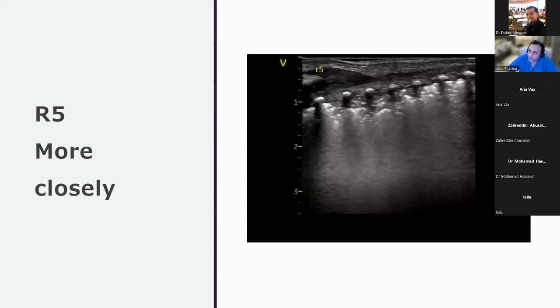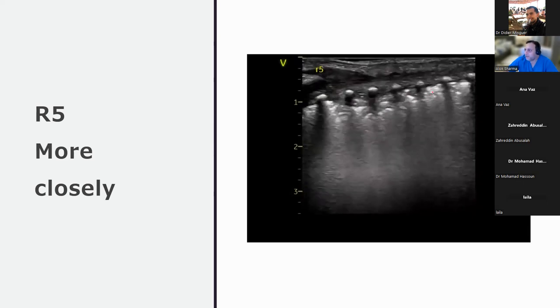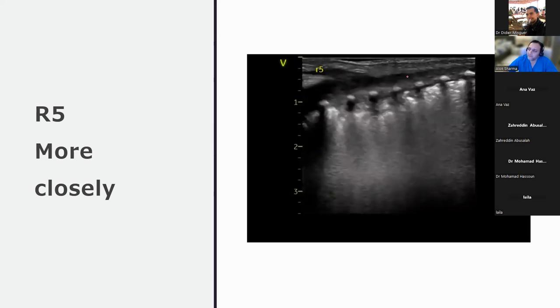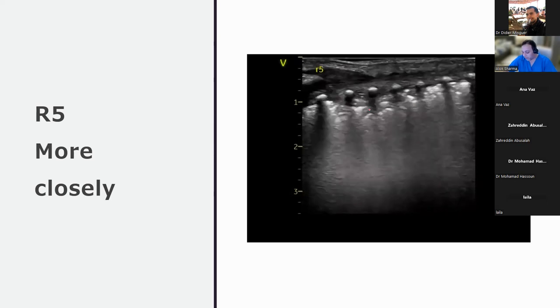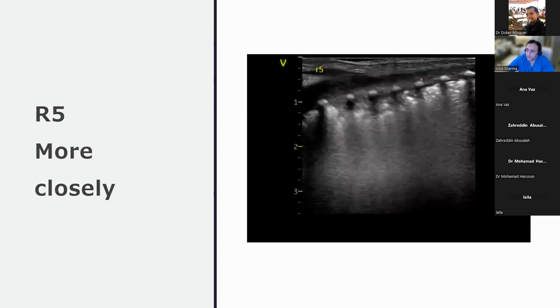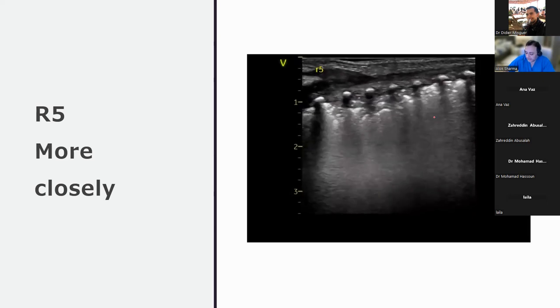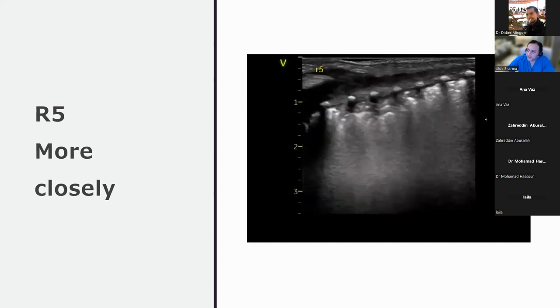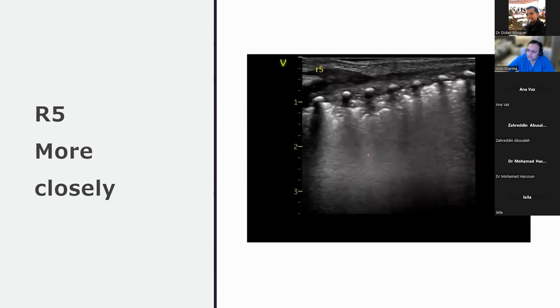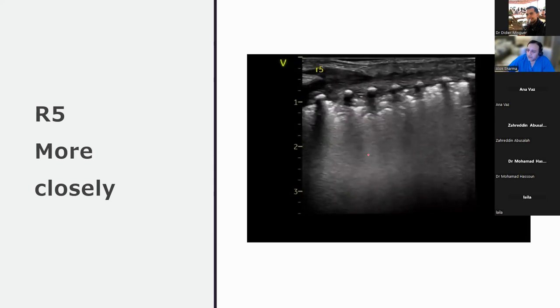So can you see how hypoechoic the margin looks? And then you've got these static air bronchograms, these bright points, but then you've got these deep consolidations where the pleura is irregular. So really, this could be one of three things. This could be a pneumonic consolidation with a little bit of atelectasis. This could be chronic lung disease with a little bit of atelectasis. And you've got a complete white-out lung. But what does this tell you about the back of the lungs? It's more severely affected, I think.